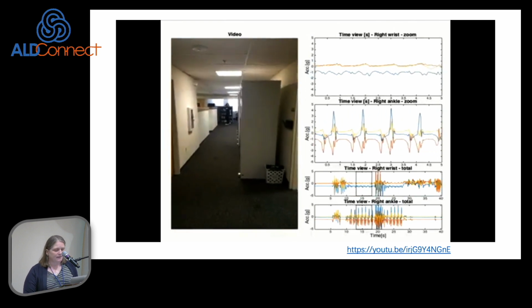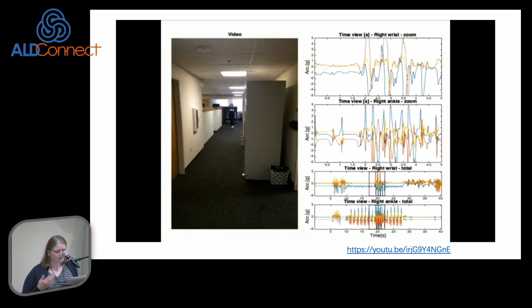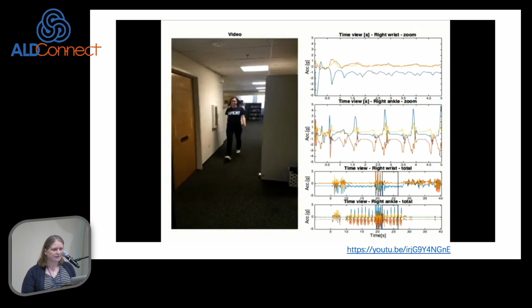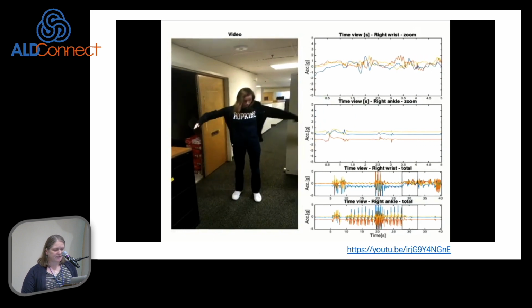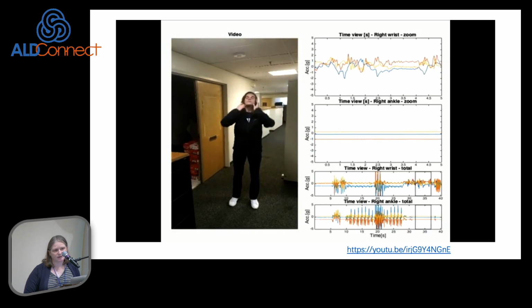And you can see how you can pick up that regular cyclical motion of the right foot and the left foot. And then when she's swinging her arms, you can tell that she's initiated some motion in her arms. And then when she stands still, you can see there's not really any activity in the leg accelerometers, but in her wrists, you can tell that she's doing dressing.